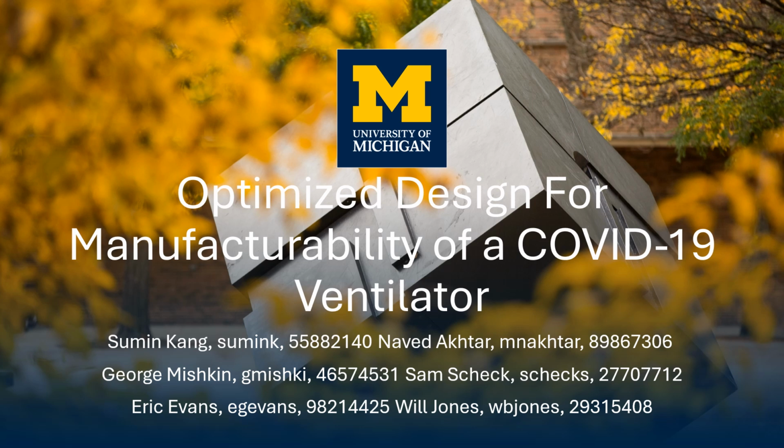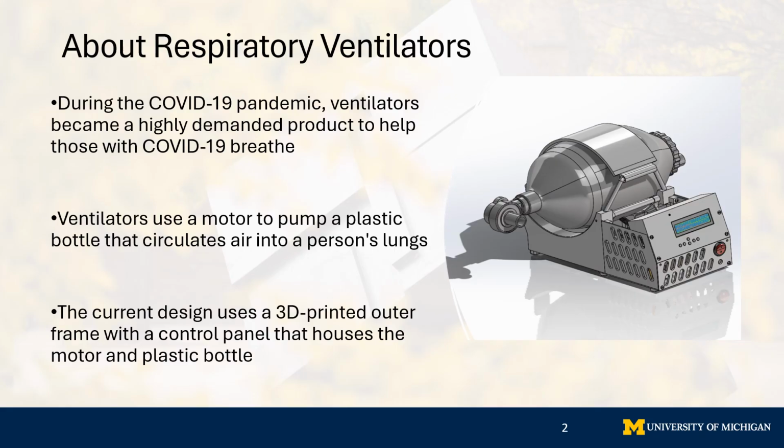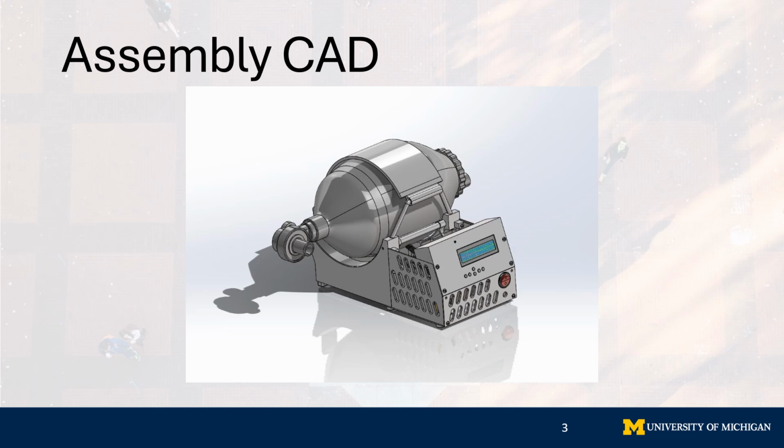We'll be presenting the optimized design for manufacturability of a COVID-19 ventilator. Ventilators were in high demand during the pandemic to help people breathe. The design uses a 3D printed frame and a motor to achieve this function. Here's a quick view on the assembly CAD that shows the base view of the product.